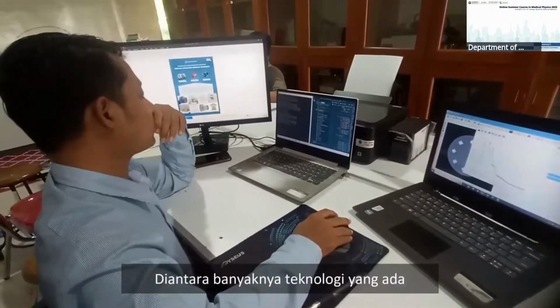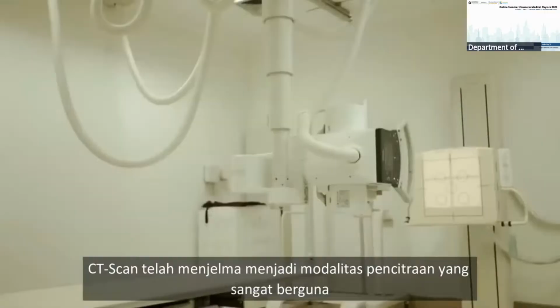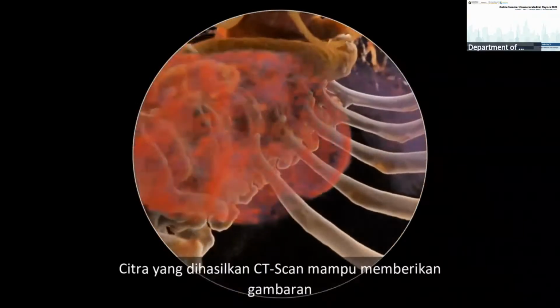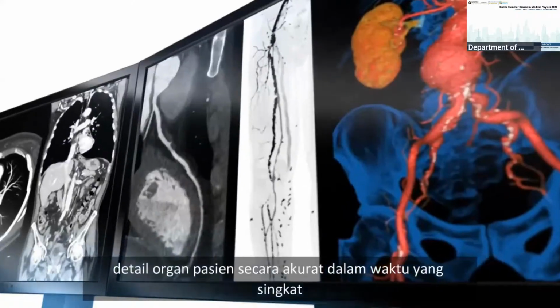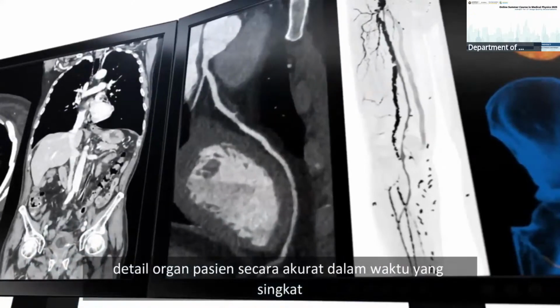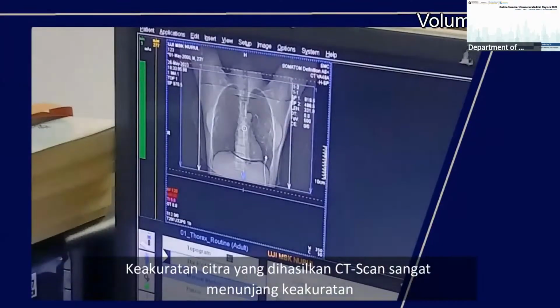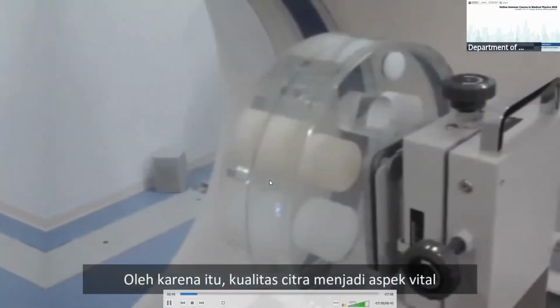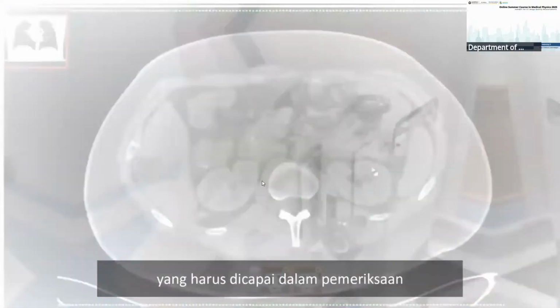Among recent technologies, CT scan has transformed into a very useful imaging modality. Images produced by CT are able to provide an accurate detailed look at the patient's organs in a short time, supporting accurate diagnosis. Image quality is a vital aspect that must be achieved in CT examinations.